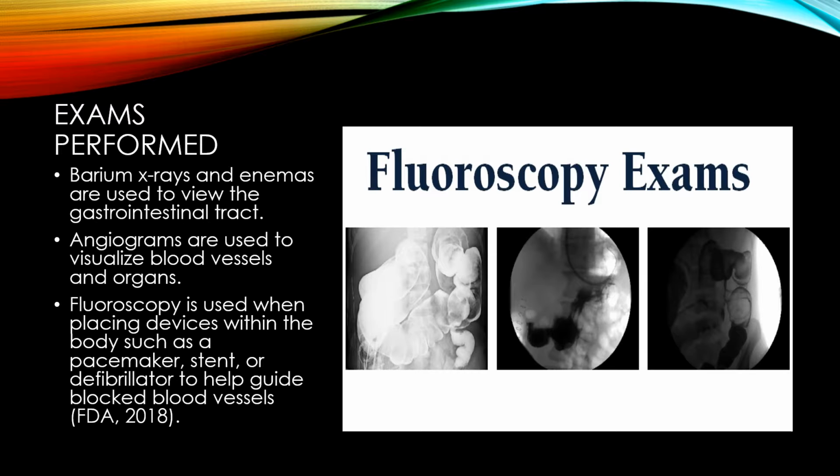When it comes to barium X-rays and enemas, it is used to view the gastrointestinal tract. Barium X-rays, video swallows, and enemas are where the patient needs to drink their contrast, or it may go in their rectum, which could take over an hour, where the radiologist observes on the monitor the insides where the barium solution makes a clear view.